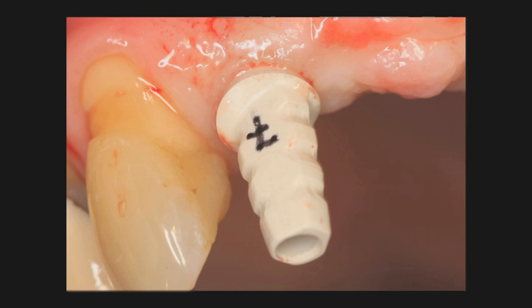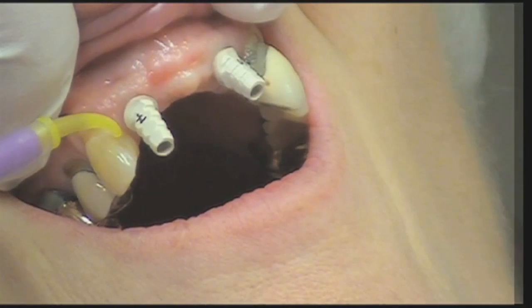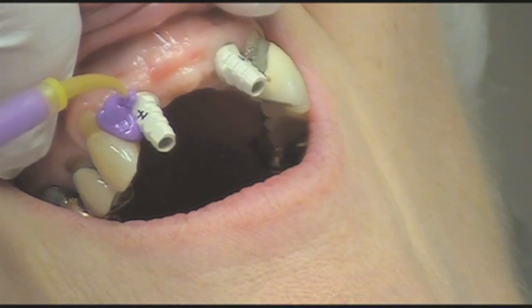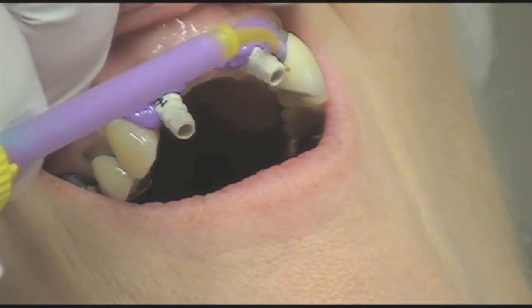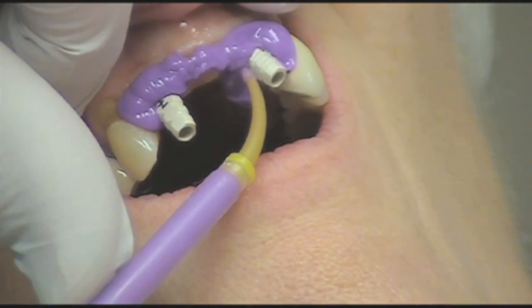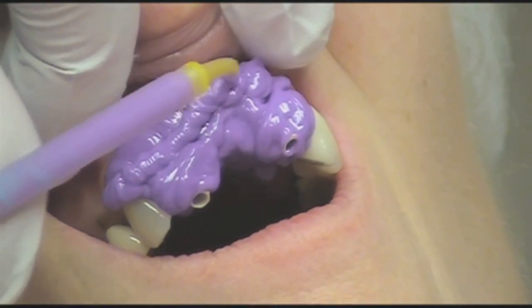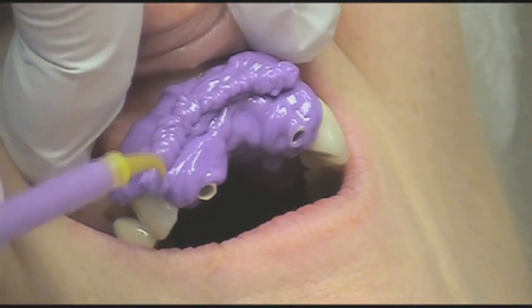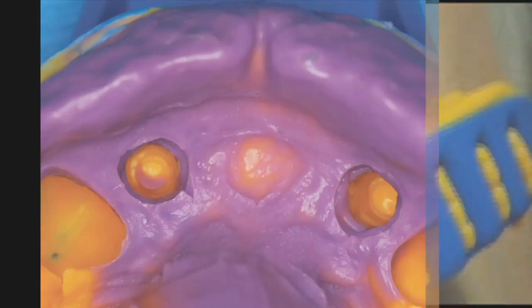copings. So we may have nice tissue healing, but then we put a straight impression coping in there. The tissue shrinks, and the laboratory at that point has to guesstimate where the soft tissue is going to be. So when we seat our final bridge, we get blanching and potential tissue trauma. All of this is done prior to any surgical intervention. An impression can be made, and the laboratory can certainly start contemplating what the final prosthesis will be.